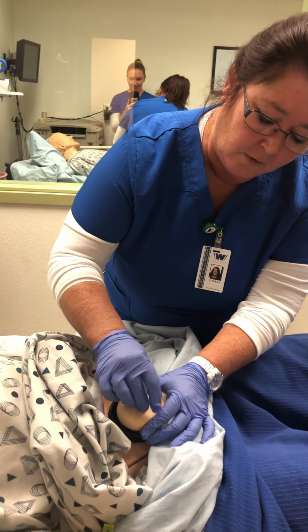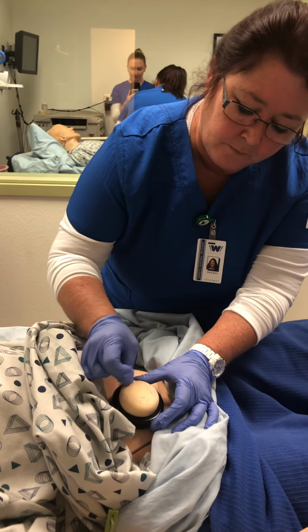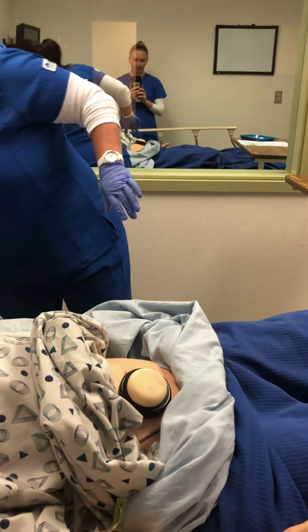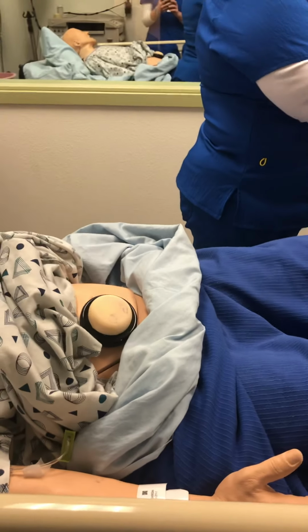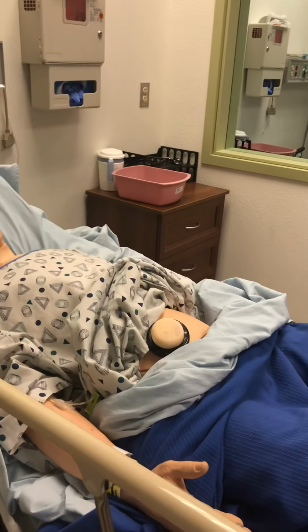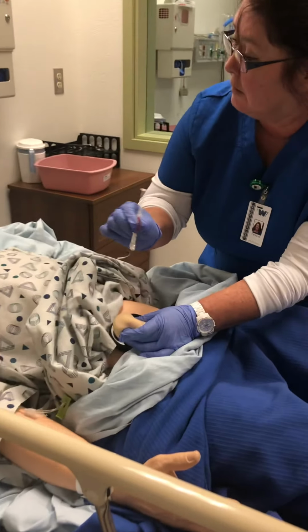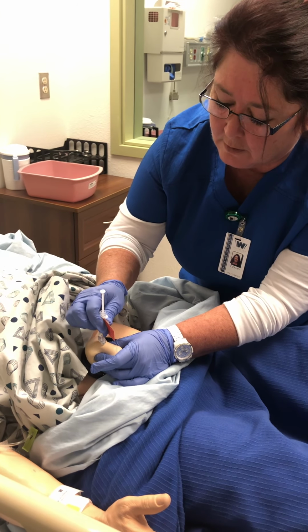We're going to start on the inside, and we're going to work our way around, making sure the site is nice and clean. We are going to let that dry for about 10 to 15 seconds. Okay, so Shirley, I'm going to pinch, and on the count of 3, ready? 1, 2, 3.